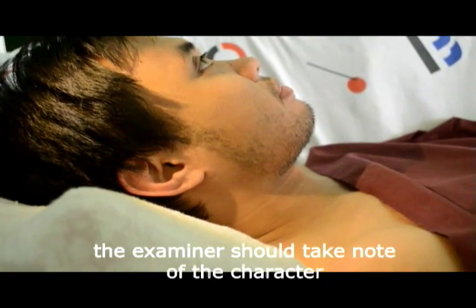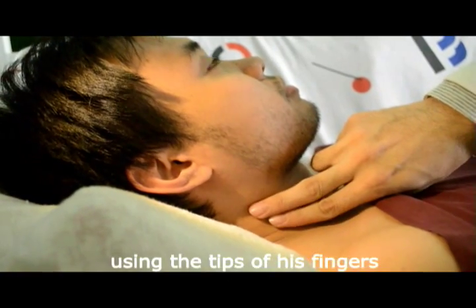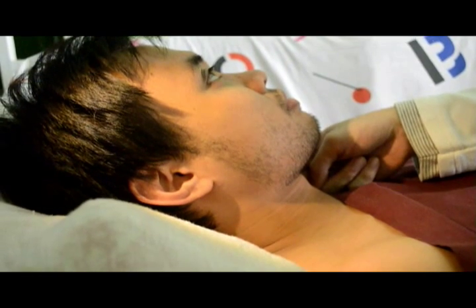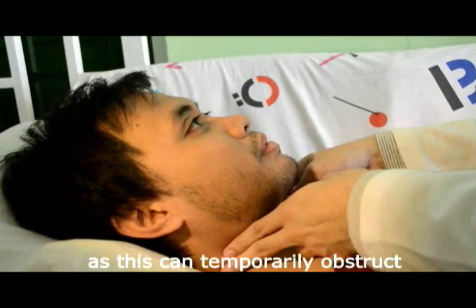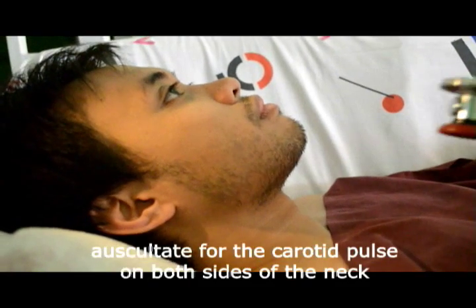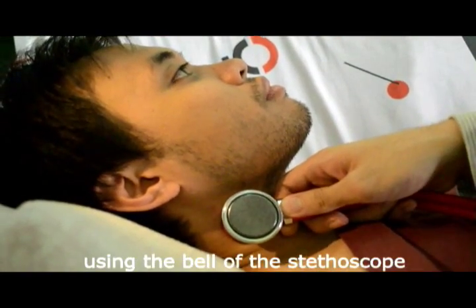The examiner should take note of the character of the carotid arteries by palpation using the tips of his fingers. Remember not to compress both carotid arteries at the same time, as this can temporarily obstruct the flow of blood to the brain. Auscultate for the carotid pulse on both sides of the neck using the bell of the stethoscope.